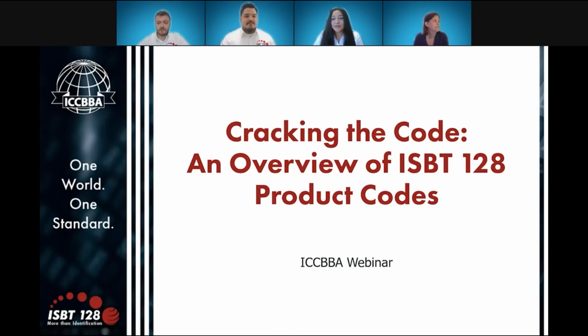Thank you, Ryan. We have a question on the core conditions. Alex, what are the core conditions for ISBT 128 product descriptions, and what does the XX in the core conditions mean? Sure, thank you for that question. This is something we briefly touched on while going through our topics today. Our core conditions are, in the first position, the anticoagulant that is present with your product.